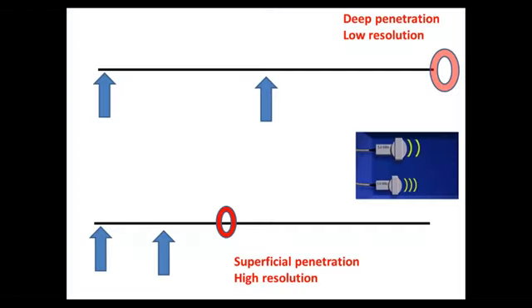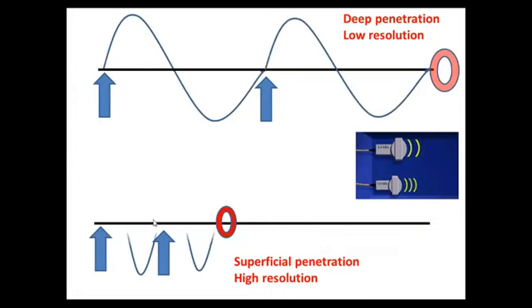General physics of ultrasound. Ultrasound is basically conversion of electricity, high rate interrupted electrical current, to ultrasound, in a very high interrupted current rate, typically between 1 million interrupted current or ultrasound waves up to 20 million. In neonates, we are usually using high frequency. So the higher the frequency, the shorter the wavelength.